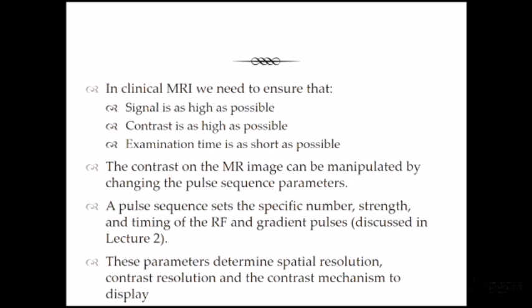So it's what defines how small a structure we can see. If our spatial resolution is quite coarse, say 1 centimetre, that makes it very difficult to see a 1 millimetre lesion, and sometimes that's what we're looking for. For instance, with breast cancer, the things that we want to investigate further are about 3 millimetres or larger. So that dictates what sort of spatial resolution we need to have.